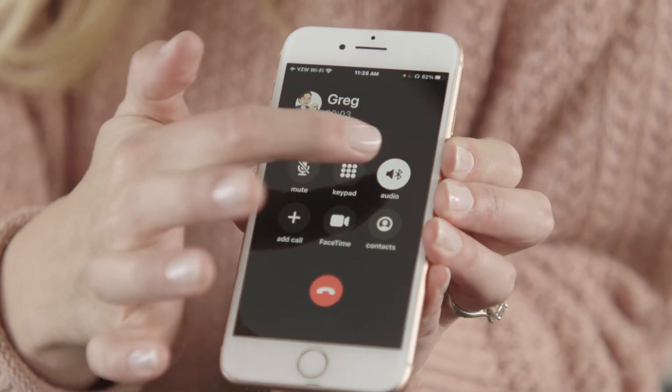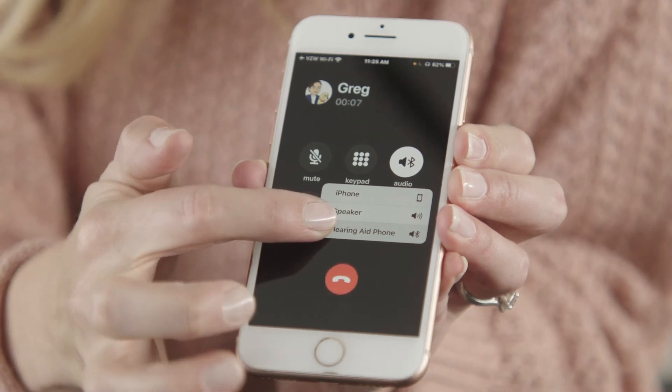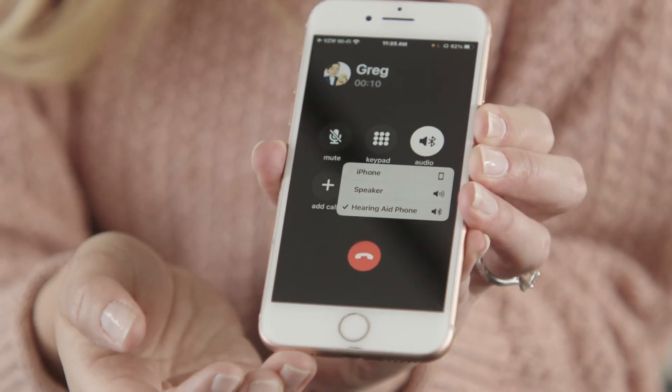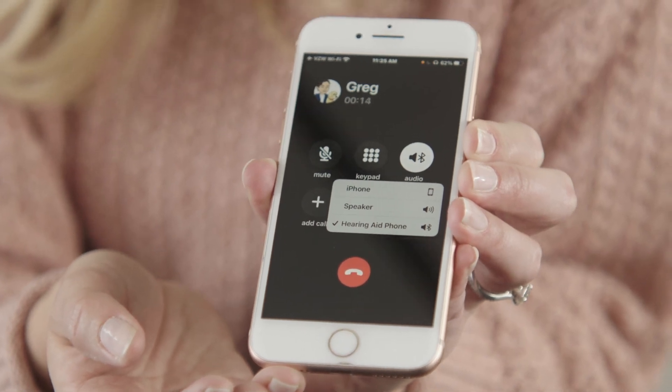To use the phone clip, once you place or receive a call, you may have to select hearing aid phone as the audio source to ensure it's streaming through your phone clip instead of directly to your Nucleus 7 sound processor or to the speaker on the phone. Now, you're up and running!